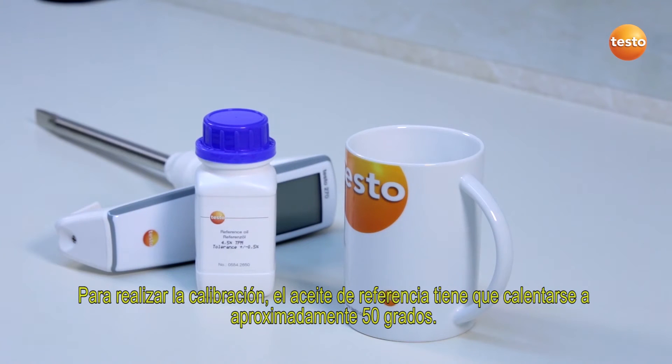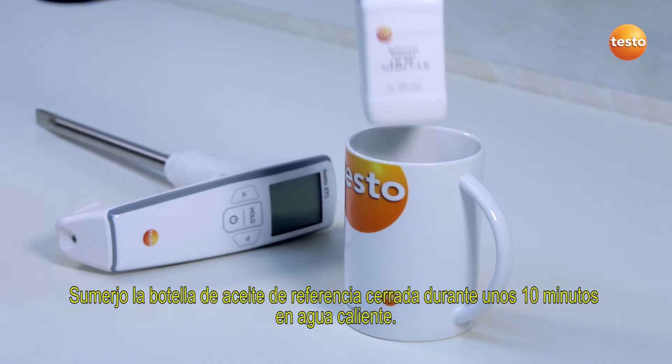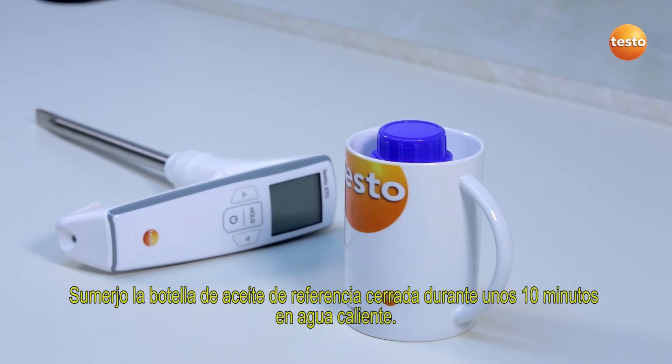In order to carry out the calibration, the reference oil must be warmed to approximately 50 degrees Celsius. To do this, I immerse the reference oil bottle in a water bath for about 10 minutes.